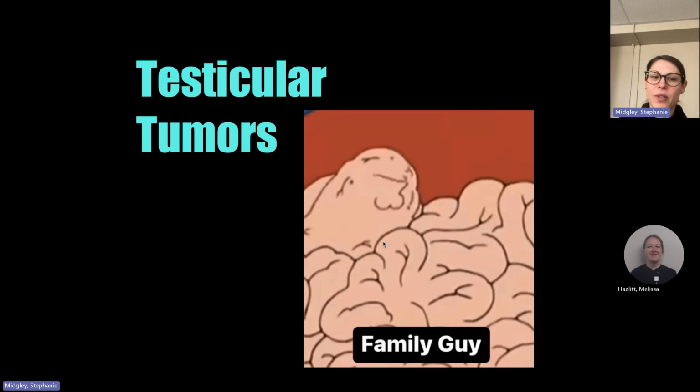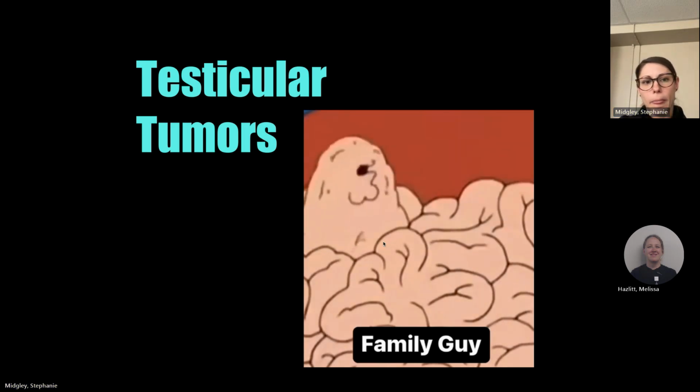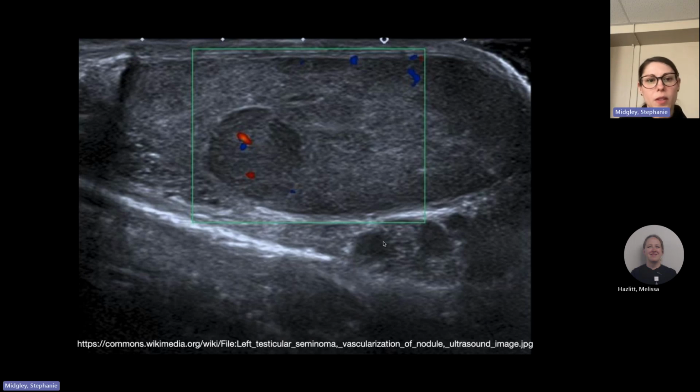95% of testicular tumors are germ cell. Seminomas account for 50% of those cases. 10% are going to present with acute scrotal pain, usually due to hemorrhage into the tumor with necrosis, and then can mimic torsion or epididymo-orchitis. So basically, they're going to present as hypoechoic areas, either focal or diffuse in an enlarged testicle. An area of heterogeneous echogenicity suggestive of intra-tumor hemorrhage and necrosis.